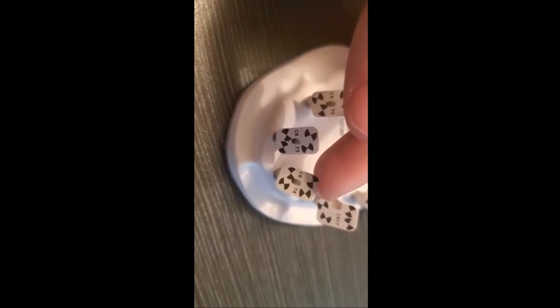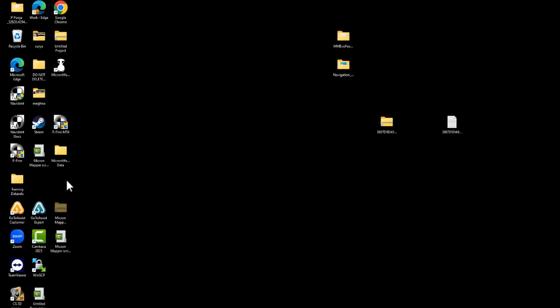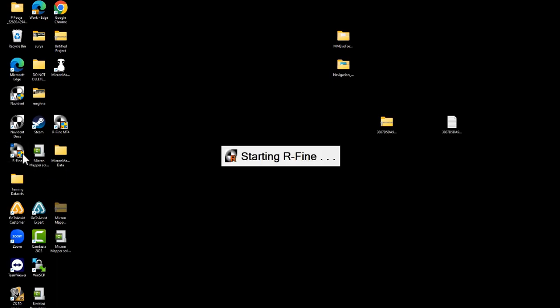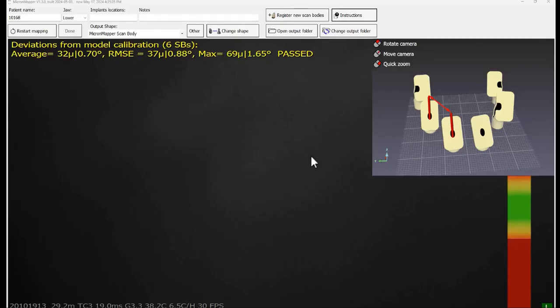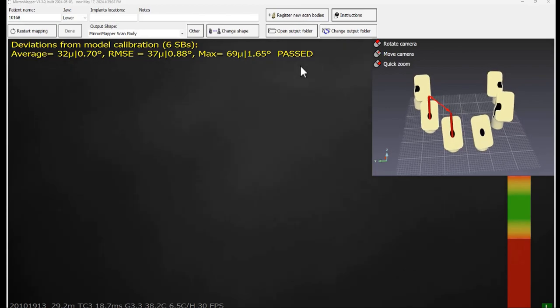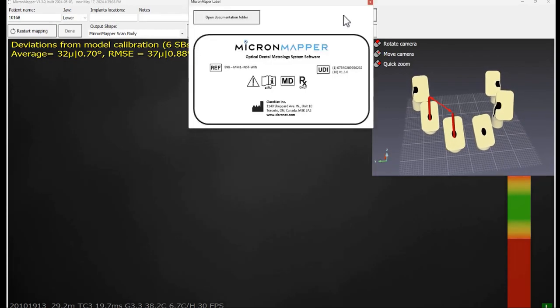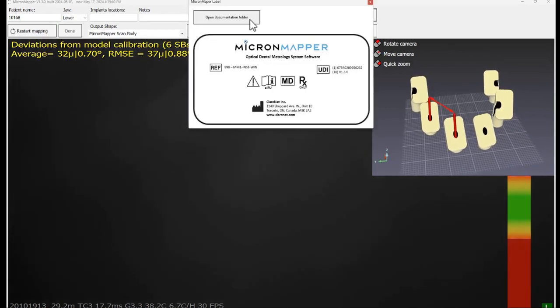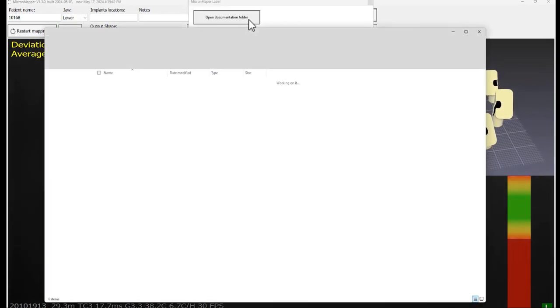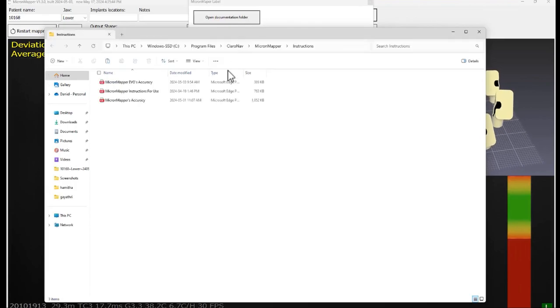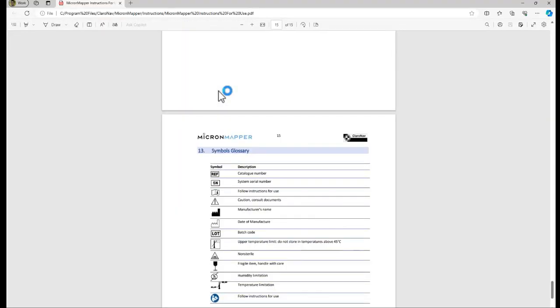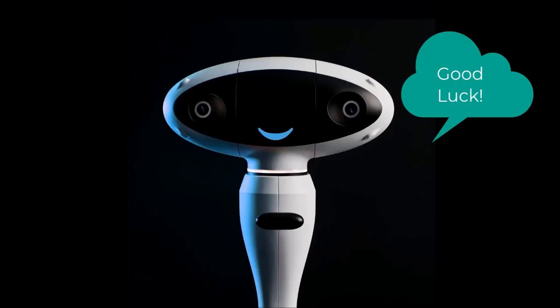A fine run is recommended if the accuracy test results are not sufficient. If you need additional explanation about MicronMapper Evo functionality, the instruction for use is attached to the software. Now you're an expert in the MicronMapper Evo. We wish you the best results and perfect accuracy during your procedures.